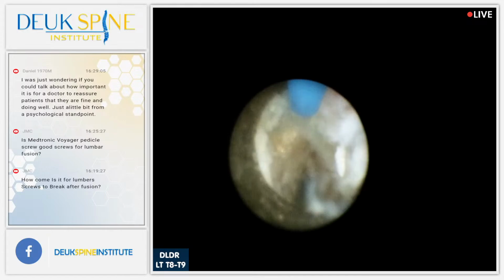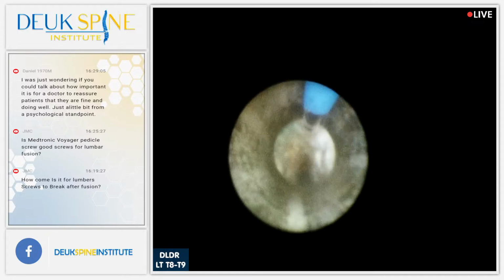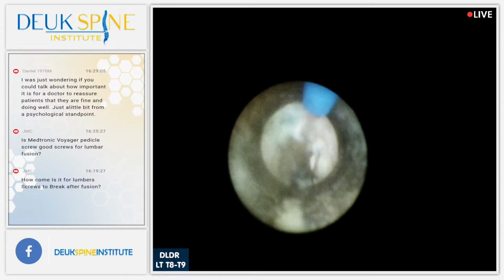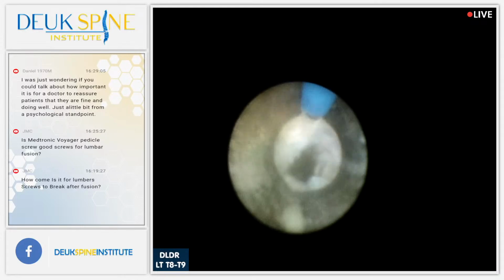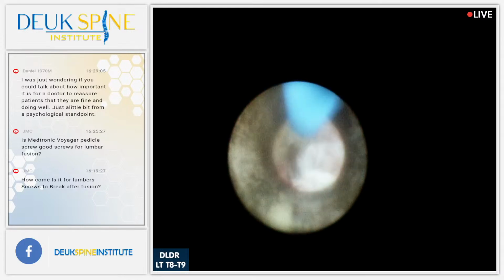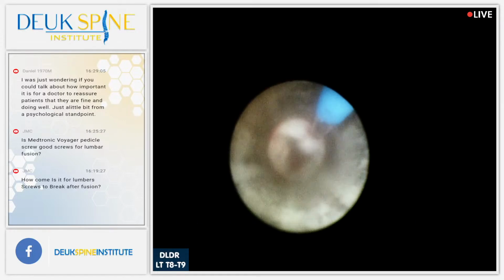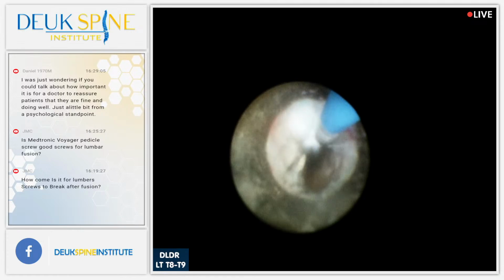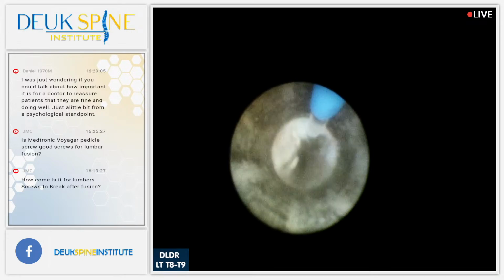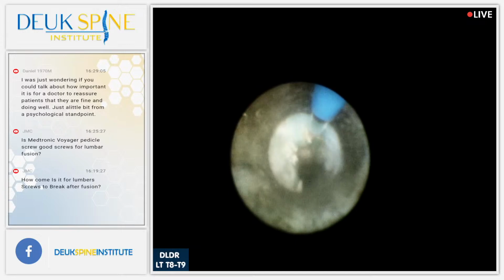That's what we're seeing. And I'm just trying to clean it all up for him. Just about out. Really right on the cusp of being outside the disc right here. Yep, we're outside now. Here we go. Done. Let me just get this. What do we got there? That should be it.